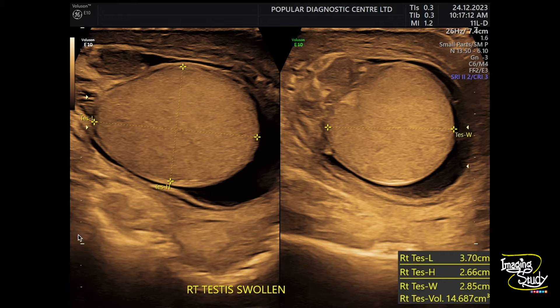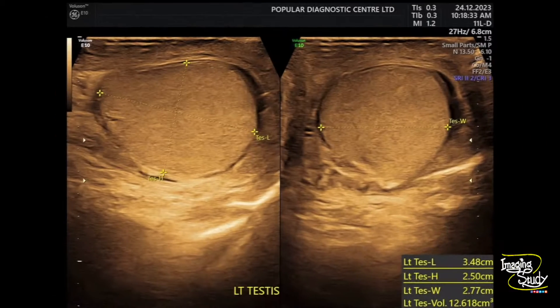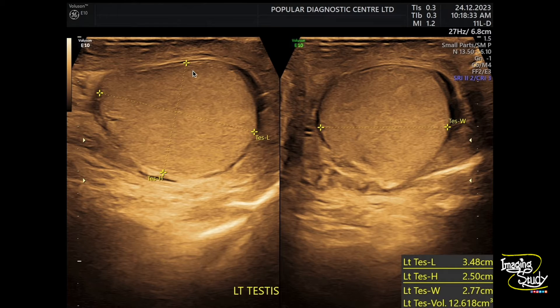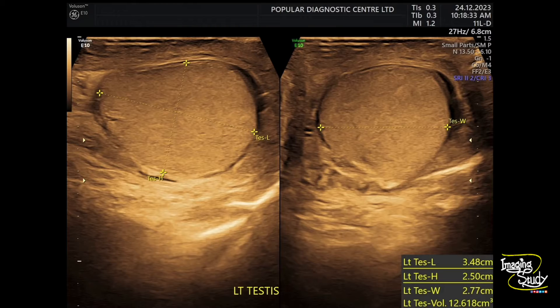Here is the picture of the right testis — it's around 14 cc, though it may vary from patient to patient, and my patient is an elderly one. The left testis is around 12 cc. So the size difference is not very obvious here, which indicates that the main affected organ is the epididymis and the testis has been affected only recently.